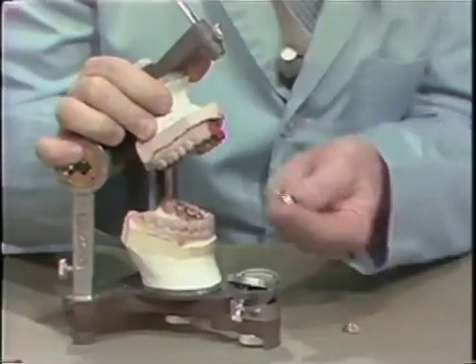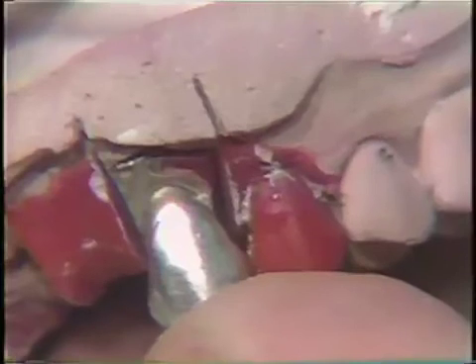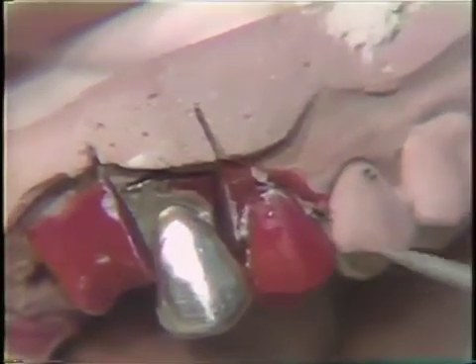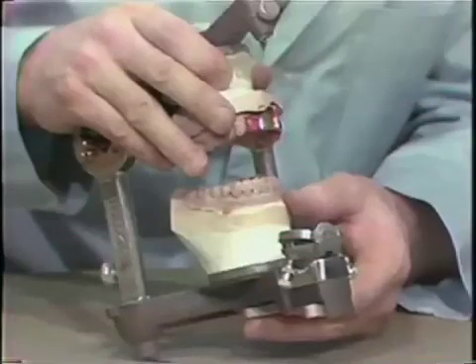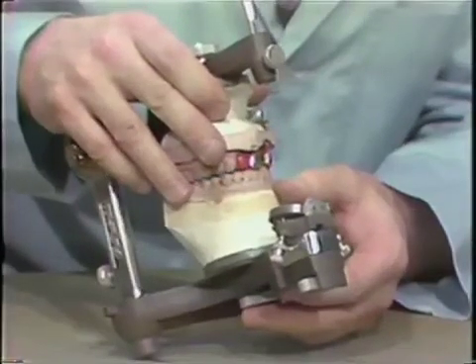The castings are then tried on the articulator. The cuspid die is seated, and the distal contact is checked. This may keep the die from seating all the way. If it does not seat, this should be adjusted at this particular time. The central incisor is also inserted, and then the occlusion is checked.